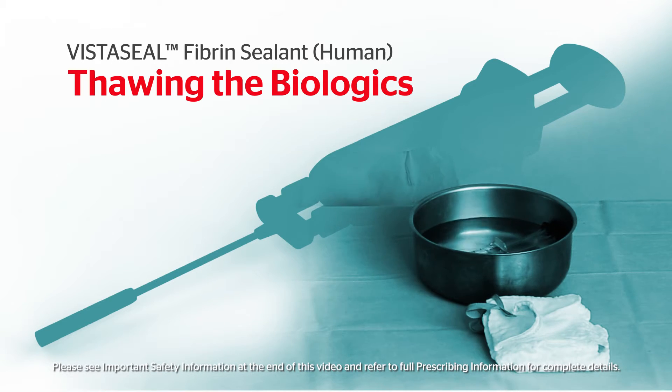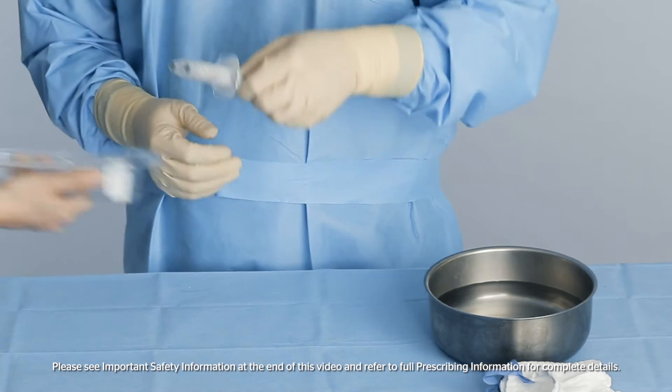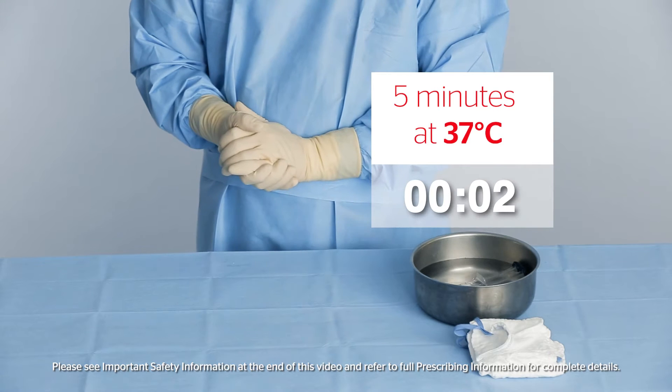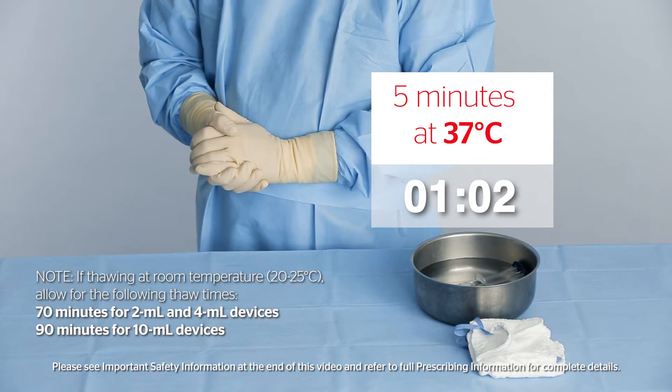VistaSeal is shipped and stored frozen and must be thawed for use. Open the blister pack containing the pre-filled syringe in the sterile field. To thaw the biologics in the syringe, place the syringe in a sterile water bath at 37 degrees Celsius for 5 minutes.